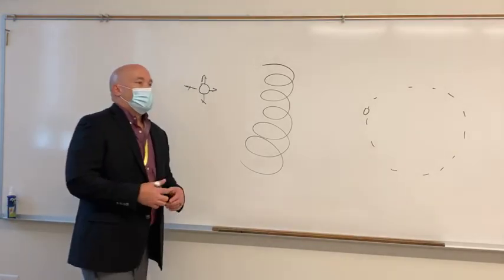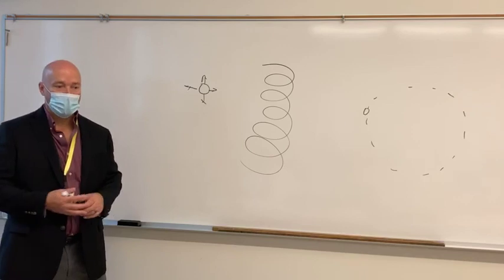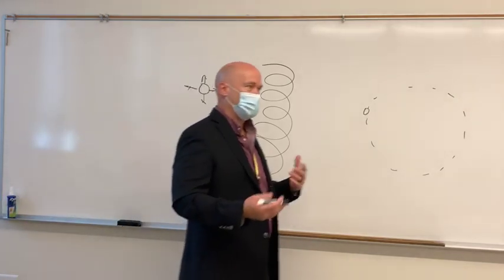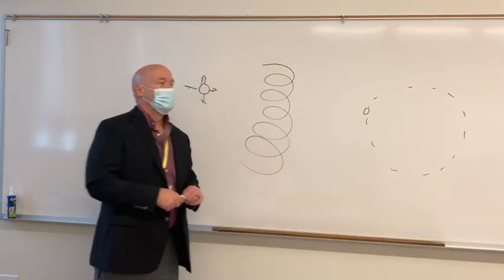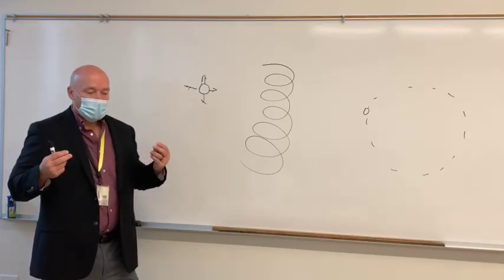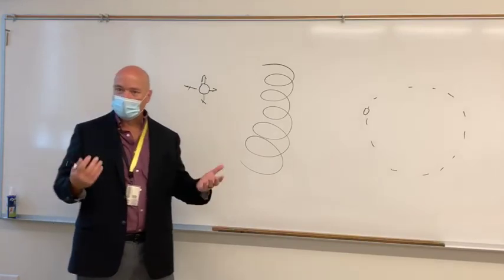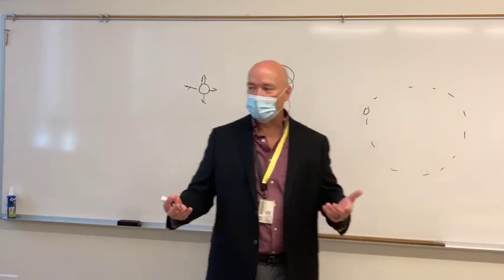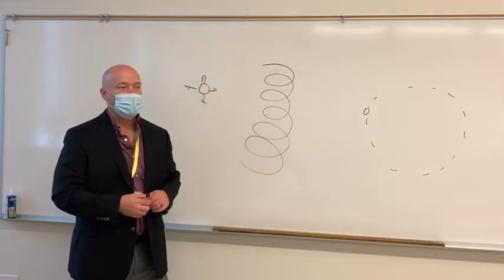So then we talked about how we learned that electricity is created with moving charge, and that was by accidental discovery. Galvani had materials that were metals of dissimilar type, and if you have metals of dissimilar type, sometimes you get an electric charge out of it.